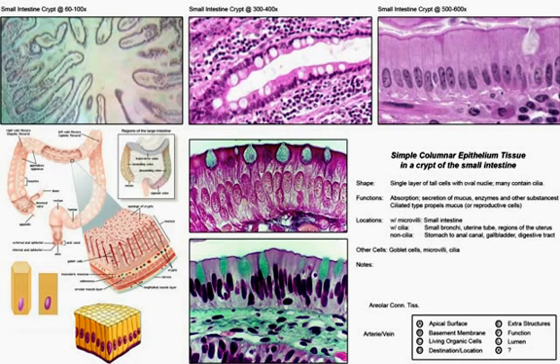Within the folds that are seen here throughout the digestive tract, each of these folds are the actual villi. Each of the villi are seen up here at a low magnification, and on the villus itself, as you magnify that, you would find a dark line or a brush border seen here on that apical surface for increasing the absorptive surface area and the absorption of nutrients that are required from the food that's been eaten.